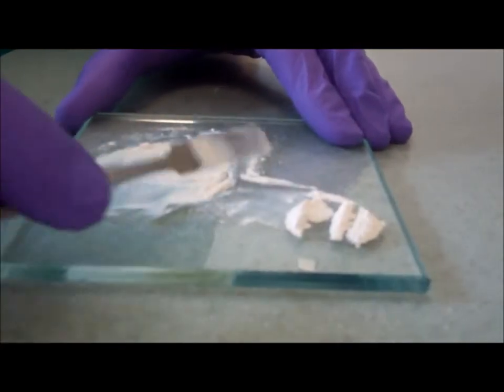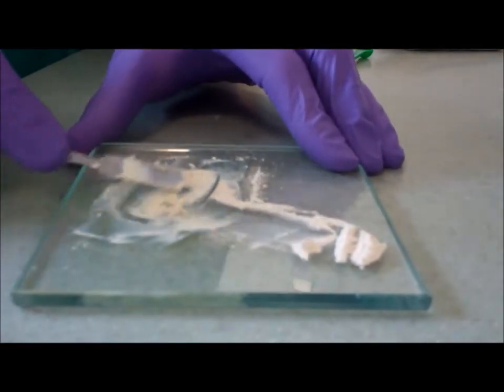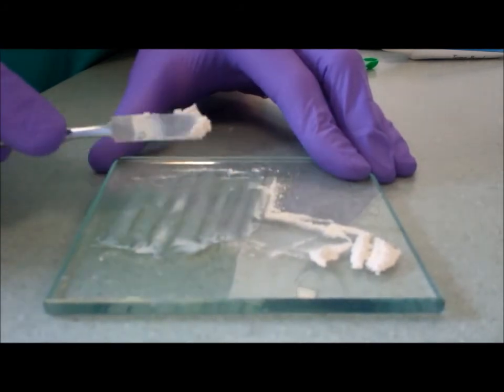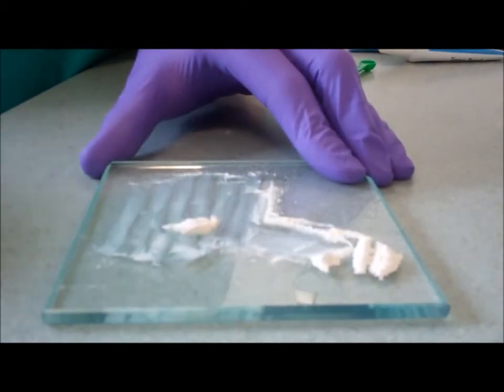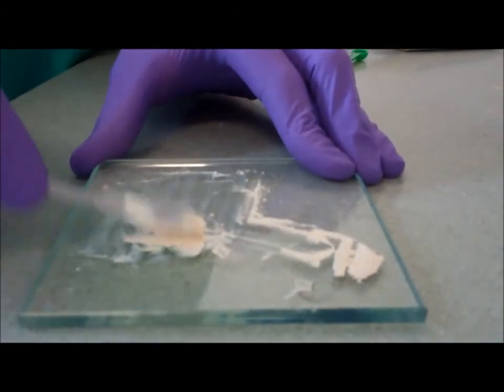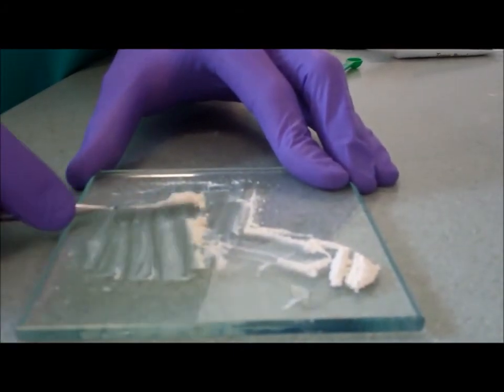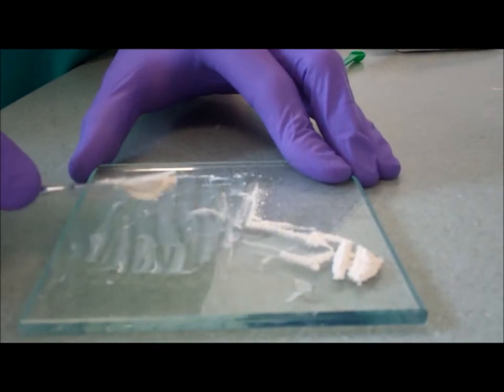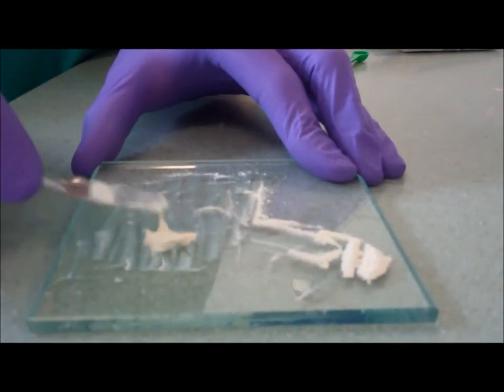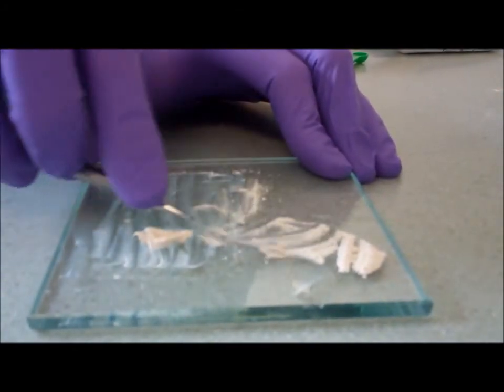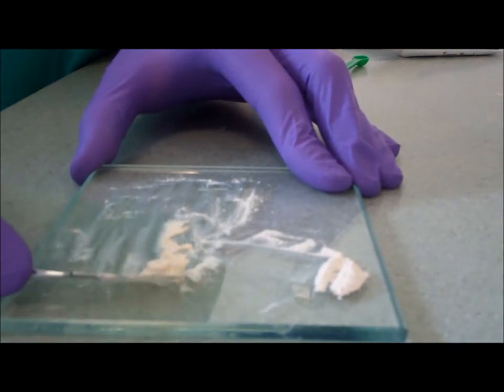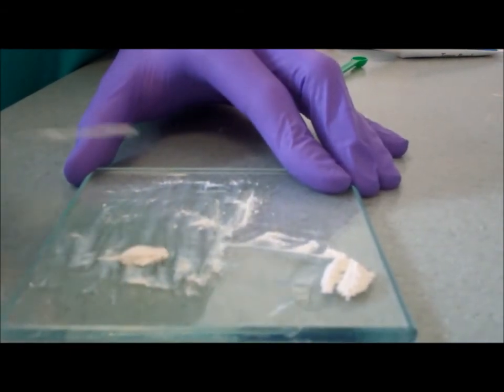Again, it's best to mix this on a glass slab, it's easier to bring it together. That's firm but a bit sticky which is probably about right for a lining. For a dressing you're just going to want to add a tiny little bit more powder, just a really small amount, just to get it so it's a little bit less sticky and holds its form a bit better.